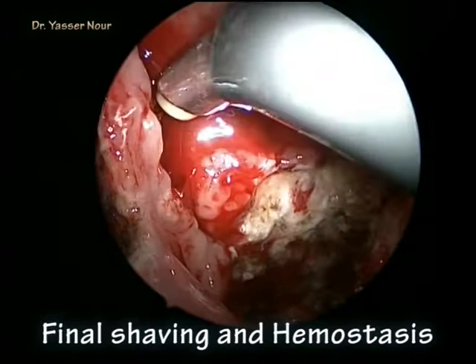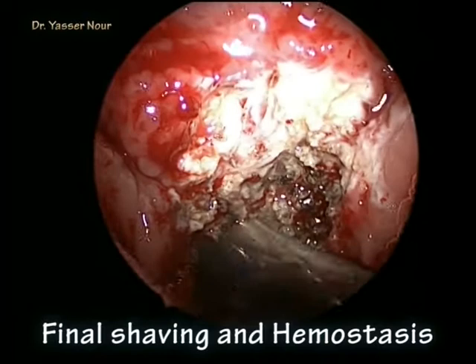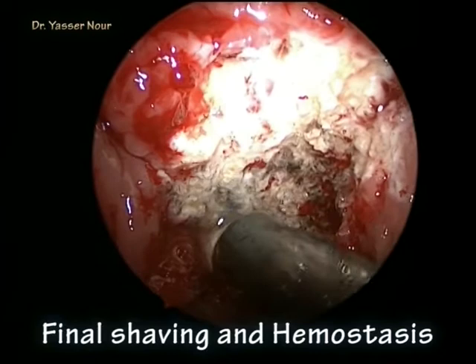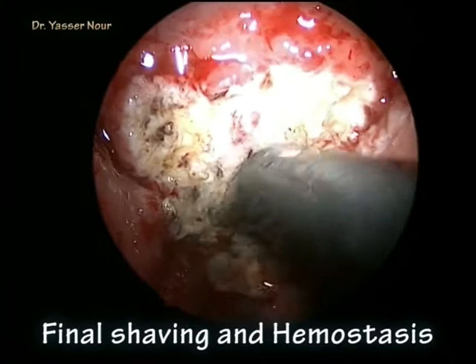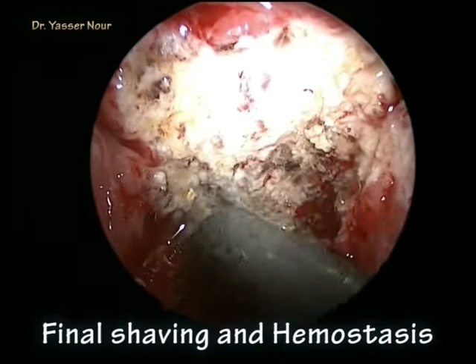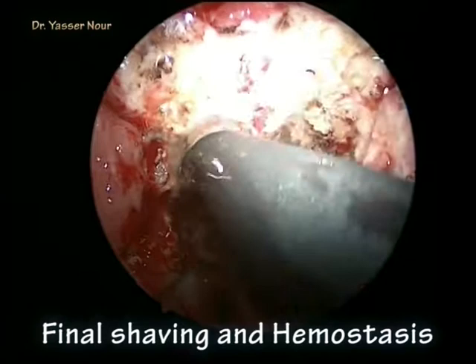As a final step, the EVAC-70 is used to perform final hemostasis by rapidly moving over the surface of the adenoid bed under endoscopic control. This is the final step, and you can see on the left side the left Eustachian tube orifice and the control of any apparent bleeding points.